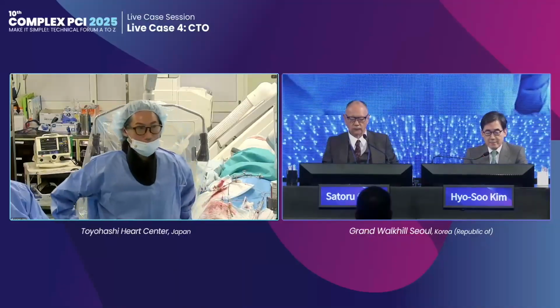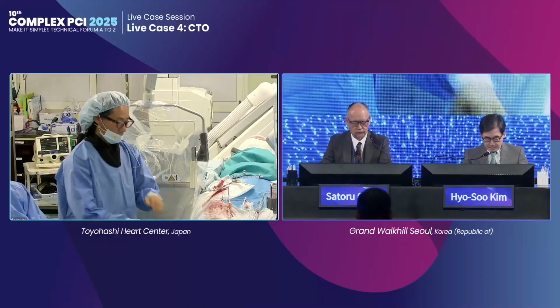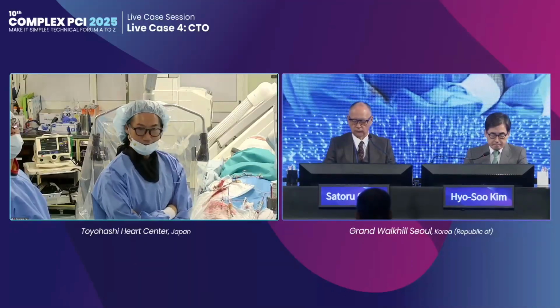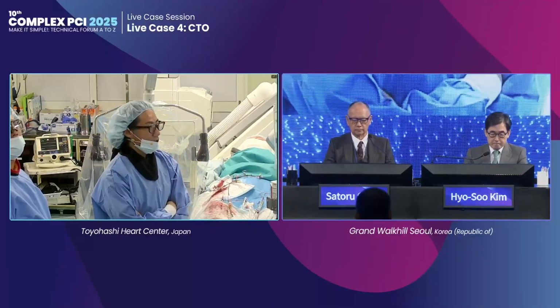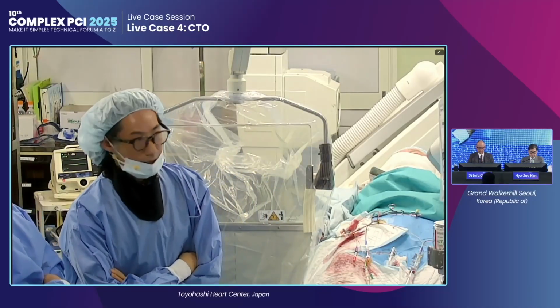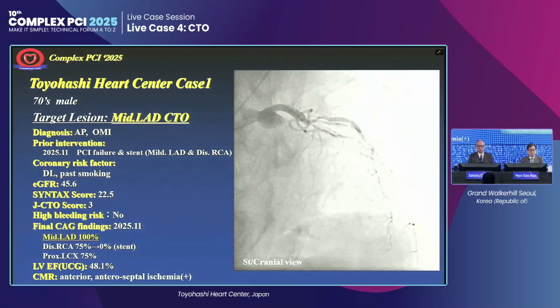Dr. Habara, let's start. Can you hear me? Yeah, we can hear you. Okay, sorry. Thank you so much, Kim Sensei. This is a great privilege for us to participate in this esteemed conference as one of the live sites. Today we prepared one case of LAD CTO. Can we perform the case presentation? Can you see the slide?